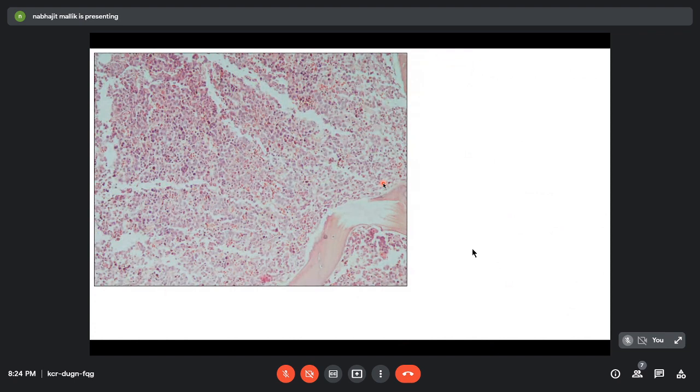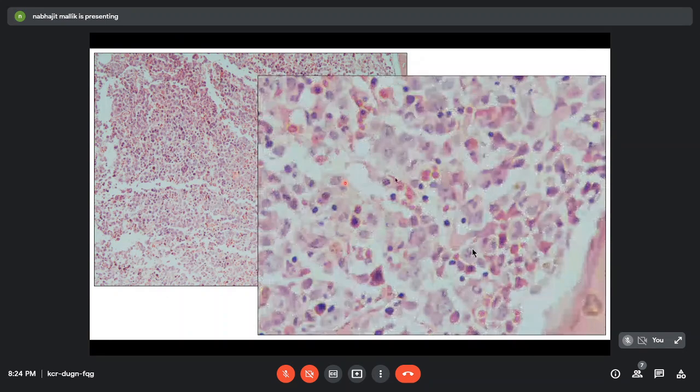There's another patient who had a pancytopenia evaluation. The hemoglobin was around 3. It's not a very good quality picture, but you can see that there are a lot of immature looking cells. If we come closer, yes, we can see that there are a lot of these cells which have absolutely opened up chromatin, and their nucleus looks very immature.